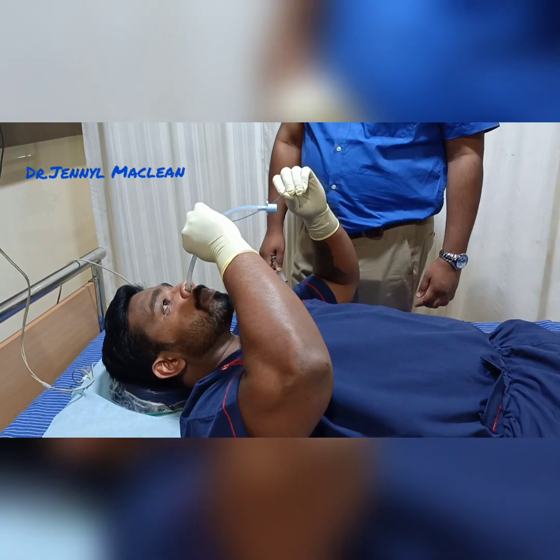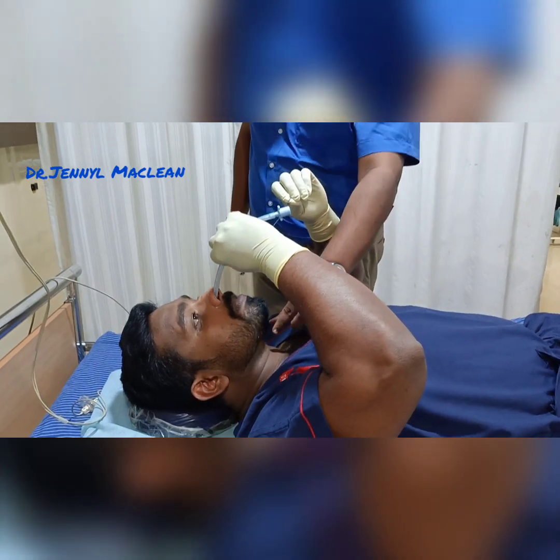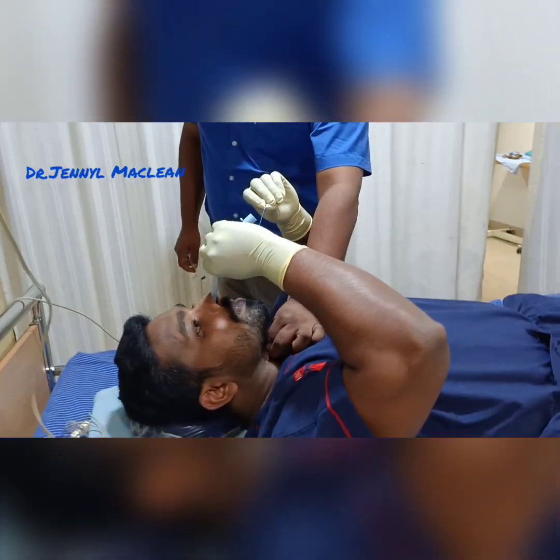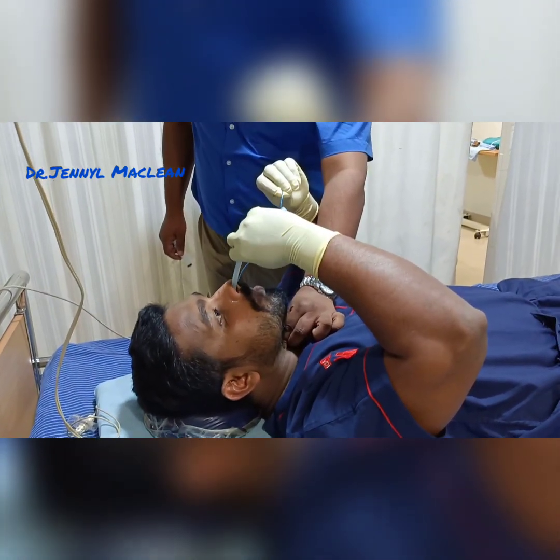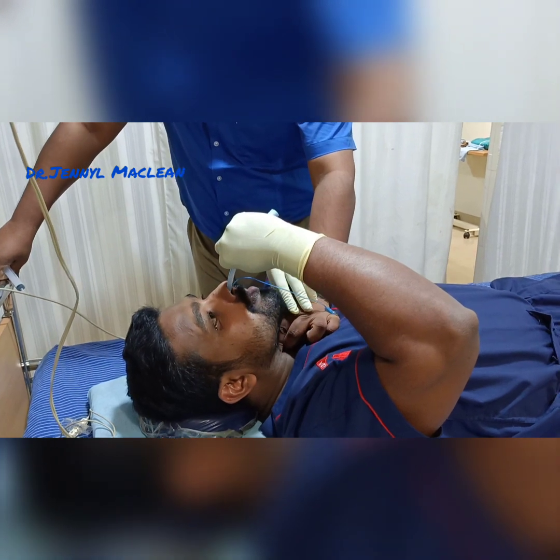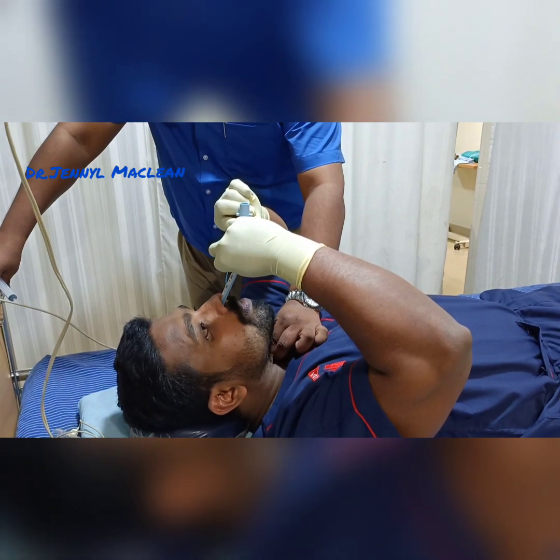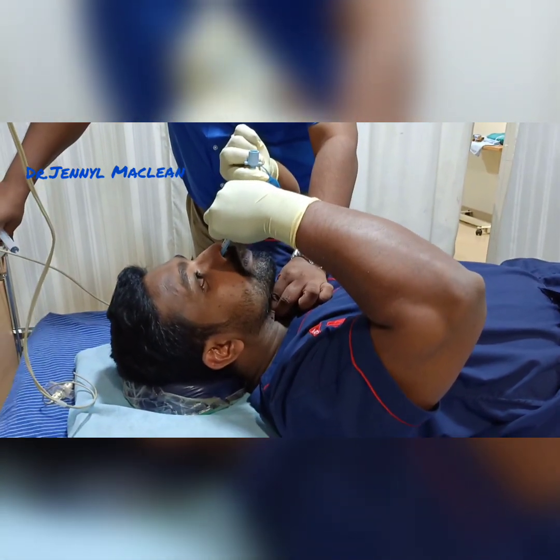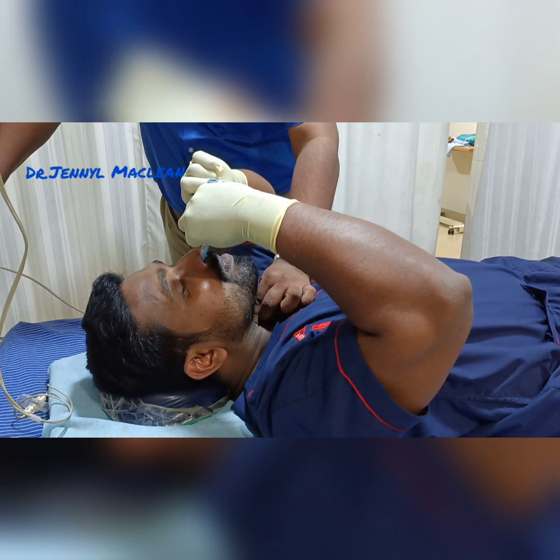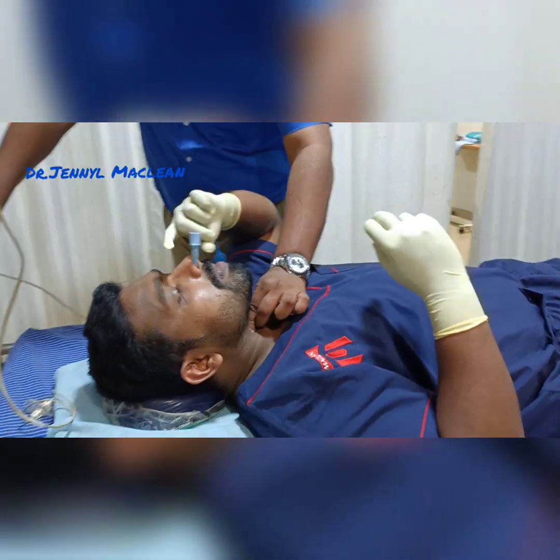What I am doing here is going perpendicular with the endotracheal tube. Go slowly. I have lubricated the endotracheal tube with lignocaine jelly also. Ask your assistant to hold your cricoid and gently give pressure. In the meanwhile, you need to keep breathing. If the patient is conscious, ask the patient to keep breathing spontaneously. You will hear the breathing sound as you pass the vocal cords. When you have a successful good airway block, there will be no hassle as the tube passes the vocal cords.